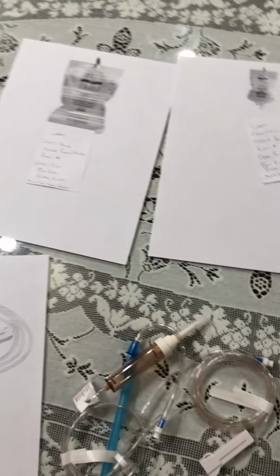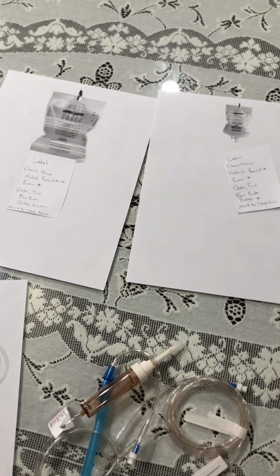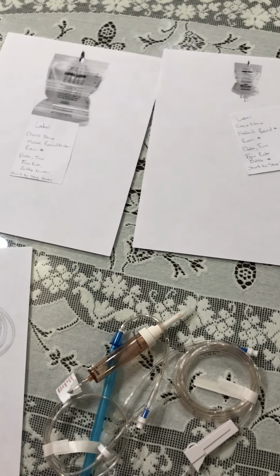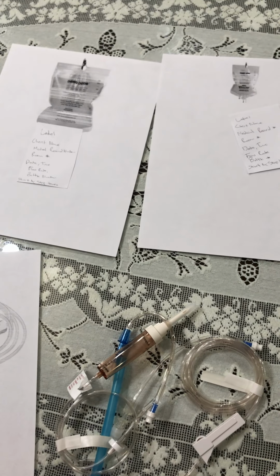Hi, my name is Brian. I'm going to be your nurse for today. And today I'm just going to be giving you some TPN and lipids. Before I begin, let me go ahead and do hand hygiene and provide privacy. And can I go ahead and see your ID band?